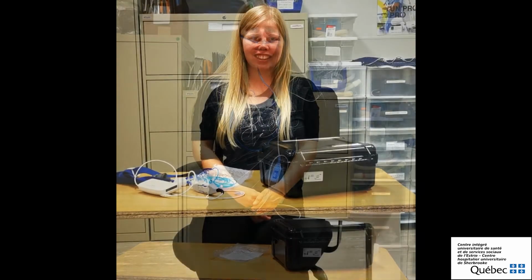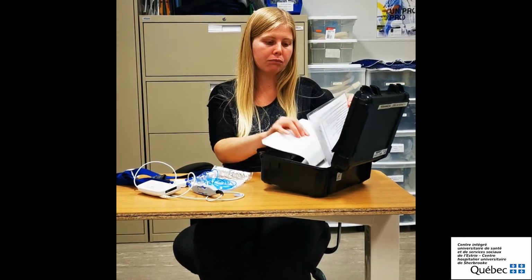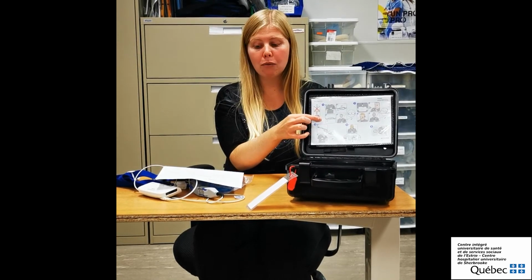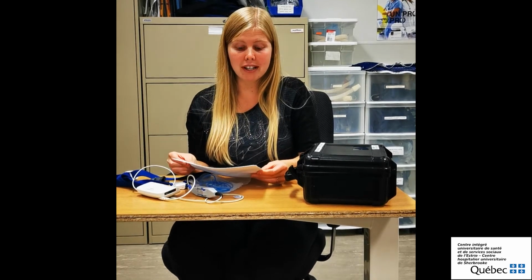Don't worry, even though the installation appears to be complicated, normally everything goes well. In the box you will find the written instructions in French and English to help you install the machine, as well as the indications on the lights. You also have some papers to fill out to help us complete the information we need to analyze your test. Among these papers, there is a paper called the Epworth Sleepiness Scale that asks you the chances that you will fall asleep doing certain activities.